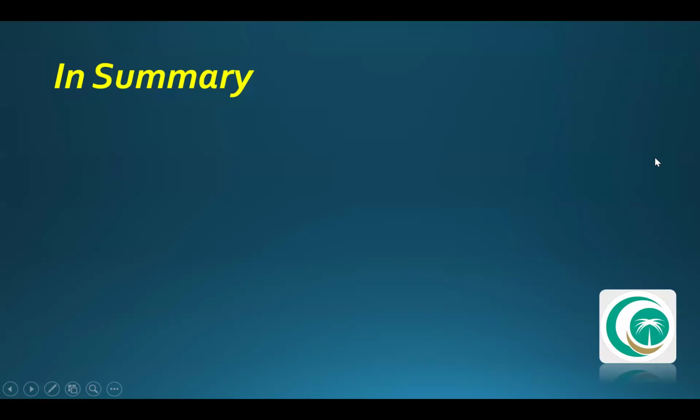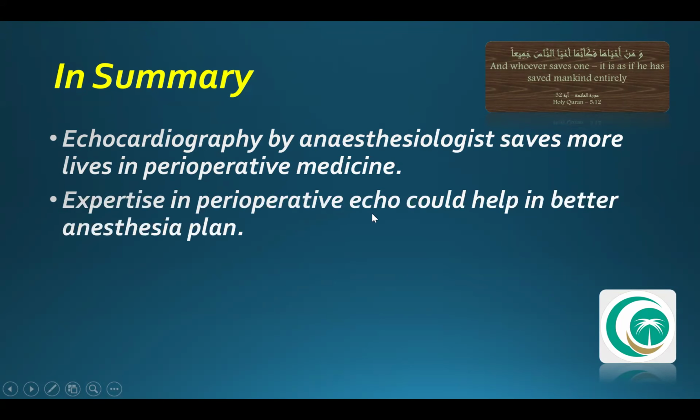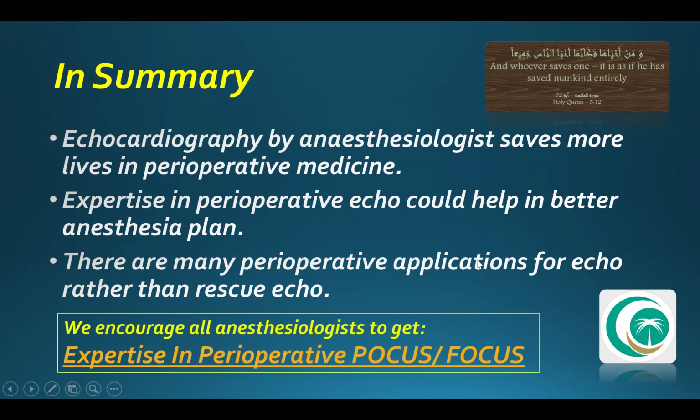In summary, echocardiography by anesthesiologists saves more lives in perioperative medicine. Expertise in perioperative echo could help in a better anesthesia plan and probably better patient outcome. There are many perioperative applications for echo rather than rescue echo. And in sum, we encourage all anesthesiologists to get expertise in perioperative point of care ultrasound or focused cardiac ultrasound.